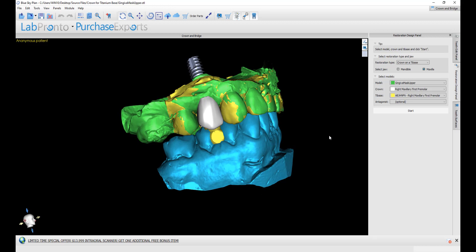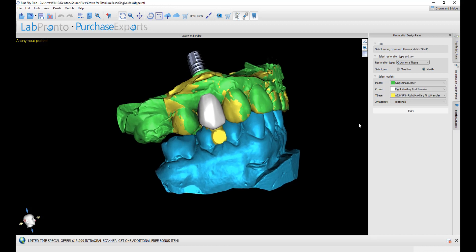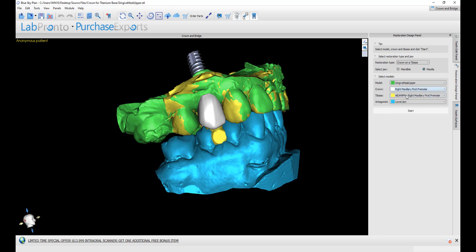At this point, we're going to select our restoration type: crown on a tie base, maxilla. The software will automatically populate the relevant surfaces, but we want to confirm them. Make sure the model selection is correct, the crown is correct, tie base is correct. And again, if you're creating multiple crowns, then it's important to confirm the correct options. Opposing jaw. Once we have the relevant item selected, we click on start.